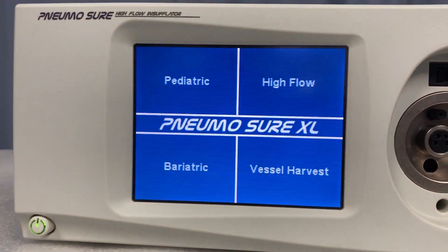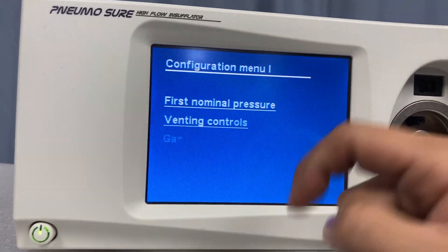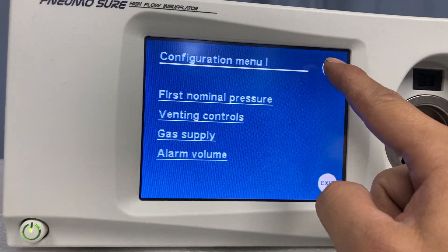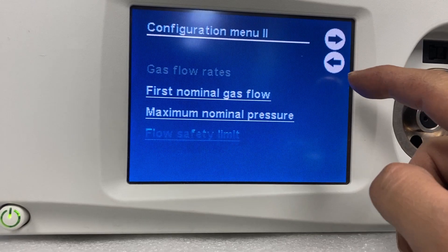Now we've got the menu screen, and from here it's quite responsive. You can see when we click it once you'll go into the necessary — just like the way it should be.